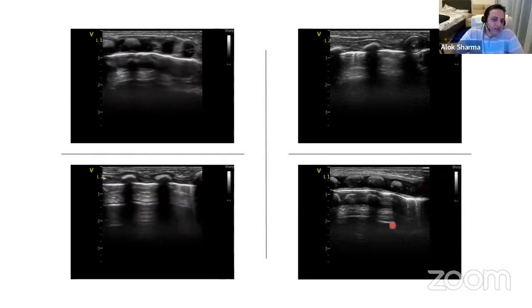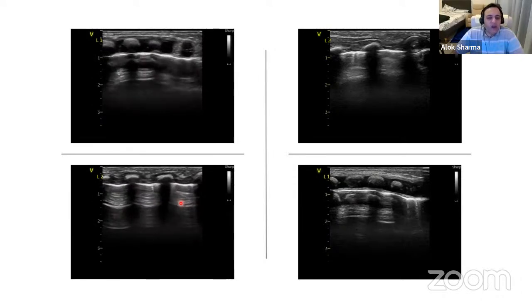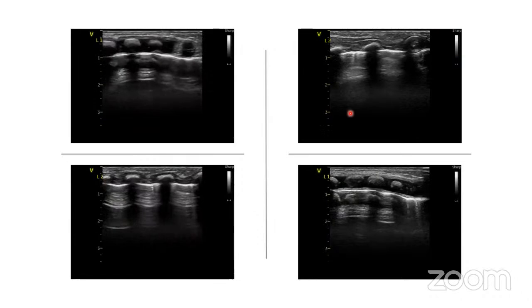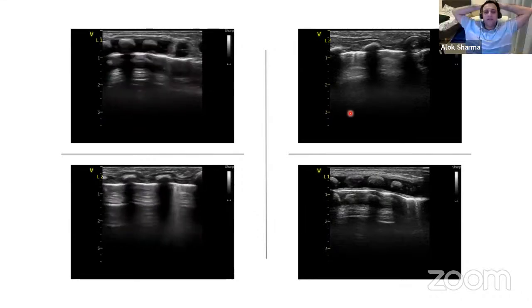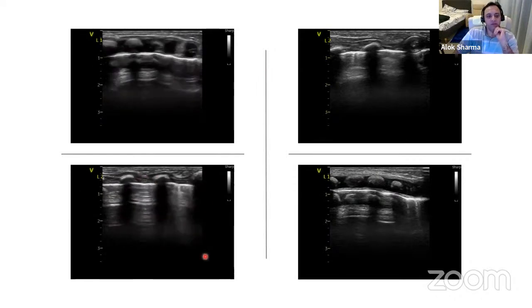And on this image, what you can see is what looks like probably a B profile, a lung profile where you have a lung point. So A profile over here, and in this area it's pretty dense B lines. So might be a double lung point at this particular point. So what do we think? The upper two spaces, they are showing bamboo sign, I guess. Yep, absolutely. These are bamboo signs. Classical, especially this area here. It's a very nice bamboo sign. We'll show you a very nice bamboo sign soon.